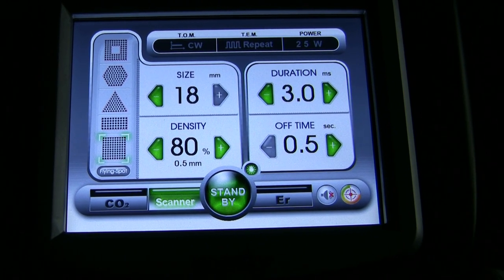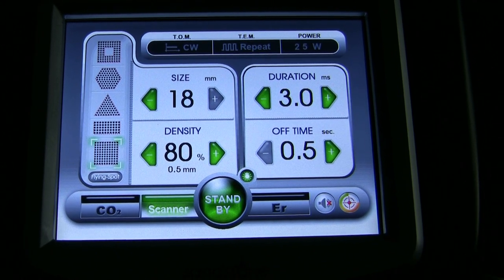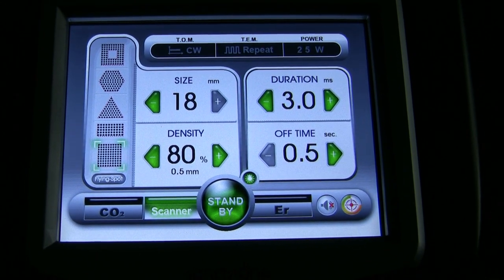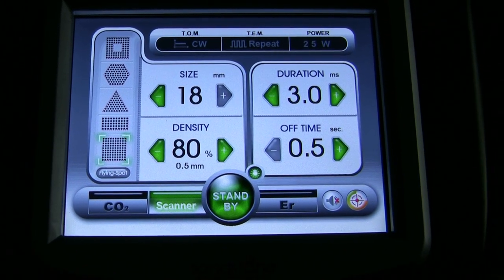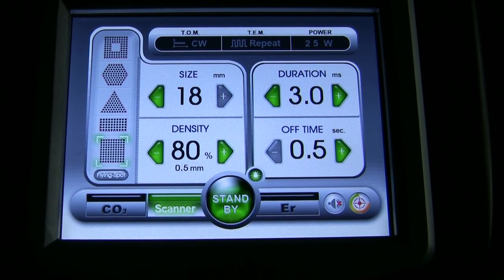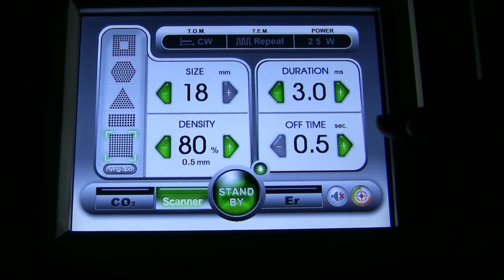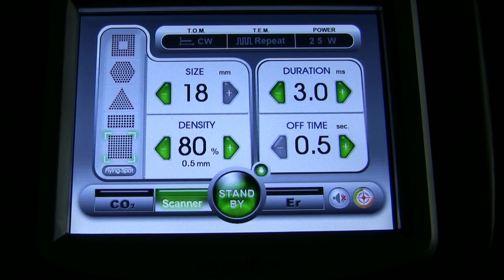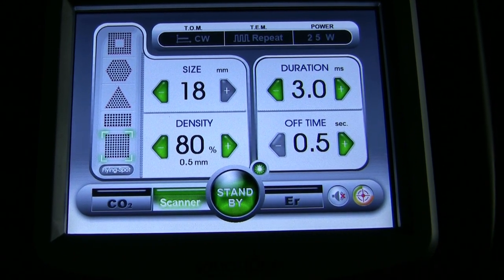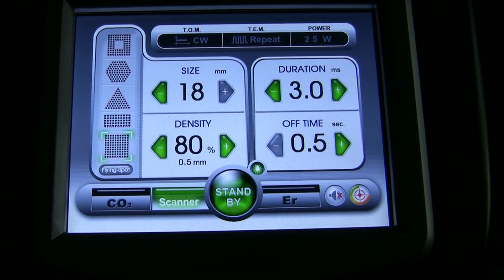Since this is fractional, that means it's not 100 percent. In other words, there's space between each little laser column that's untreated tissue, which is the basis of fractional. Our pulse duration is three milliseconds and the time between one pattern to the next pattern, if you keep the foot pedal depressed, is a half second. So we are in the scanner mode and we're going to do some fractional facial resurfacing.